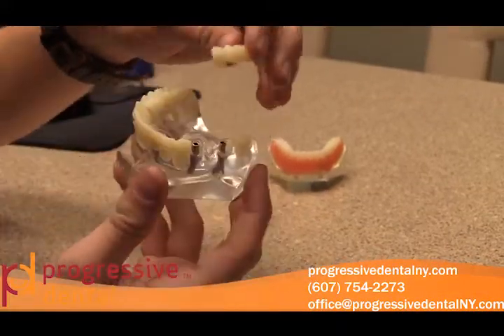The implant is placed into a very specifically tapped hole, designed to be the exact size of the implant. So the implant goes in and engages the bone around it, but it doesn't torque it or damage it. Then it's allowed to heal and the gum is covered back over it. The bone at that point will start to integrate, or mesh or merge, with the implant so the two become one. It's called osseointegration.